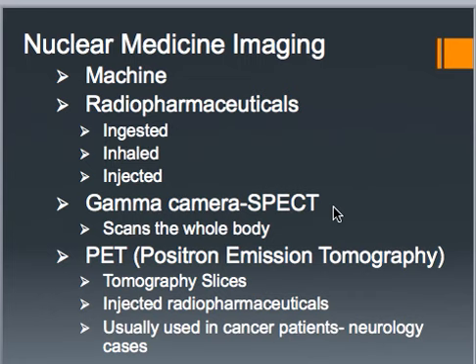But I think one of the first original pictures I showed you was from an old scanner that only had one on it. So SPECT imaging involves the rotation of the gamma camera heads around the patient or the body part to produce a more detailed 3D image.